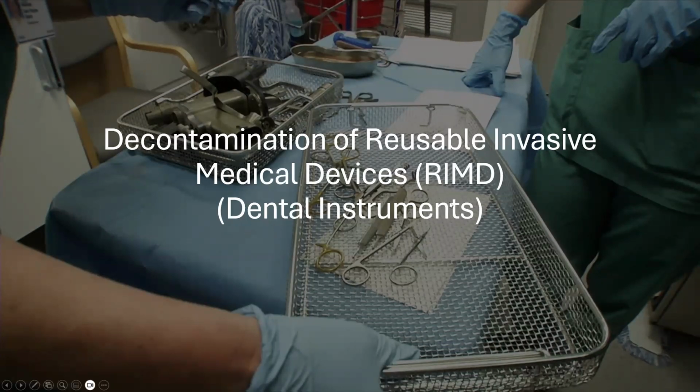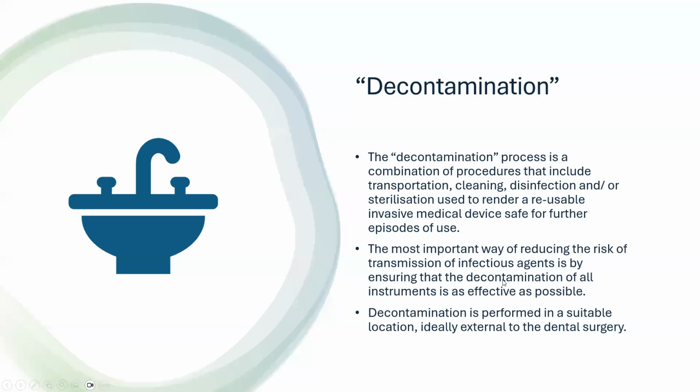So we will be discussing the dental instruments which we use in operative dentistry, in periodontal surgery or periodontal dentistry, or the instruments which are being used in oral surgery. So various instruments, which we call reusable invasive medical devices, how they should be decontaminated.